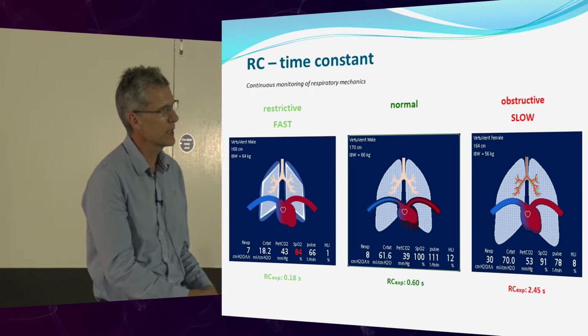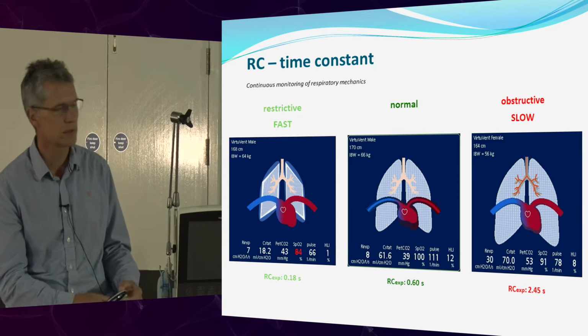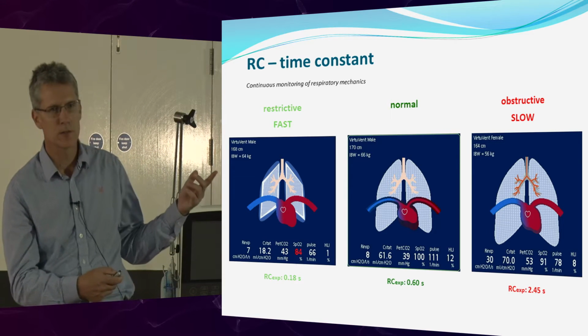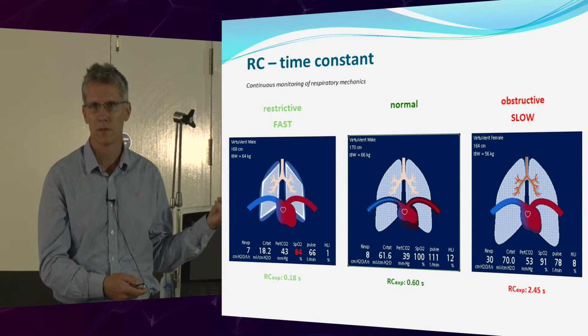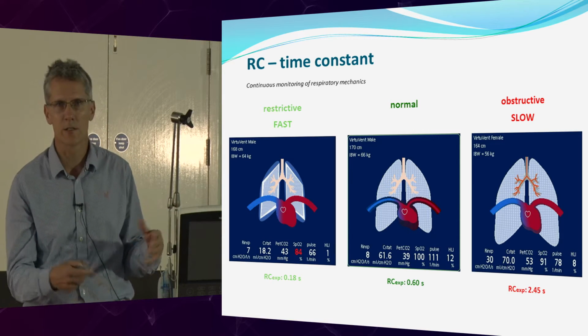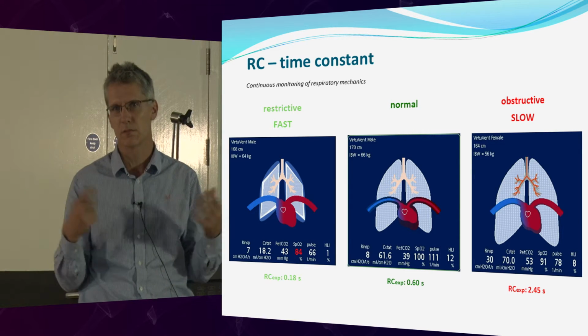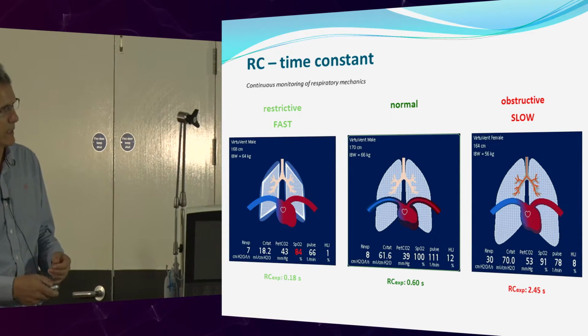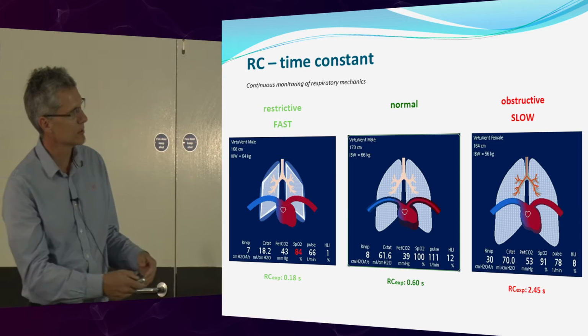The COPD patients, we hardly ventilate any of these now. I don't know clinically what you find. They all get non-invasive, don't they? The COPD patients you see are usually the ones that are post-op. Yep. Their inspiratory pressures tend to be quite low, about 10. But their time constant tends to be quite high, and their tidal volume is a little bit higher as well.